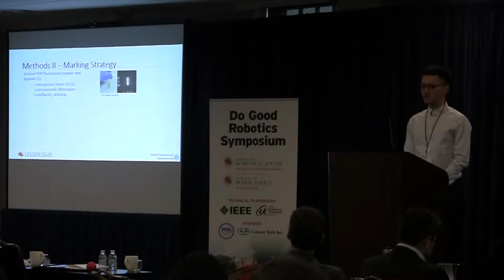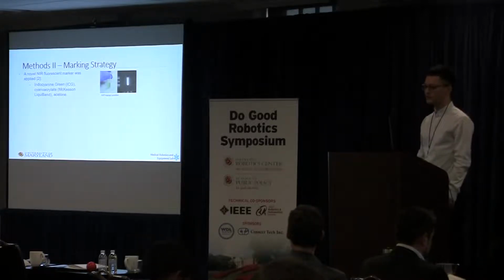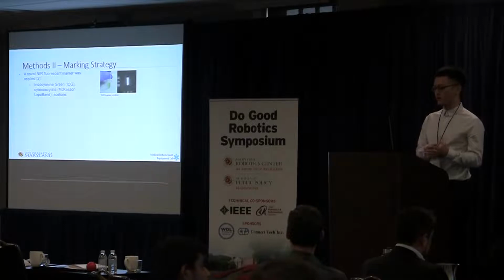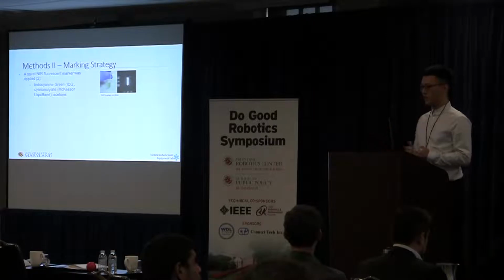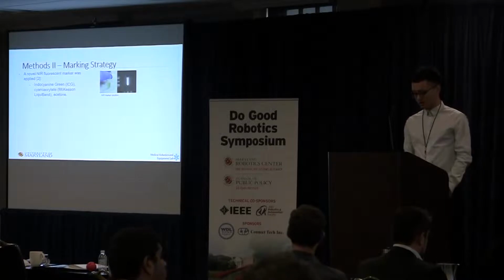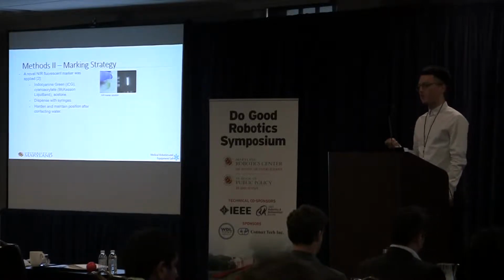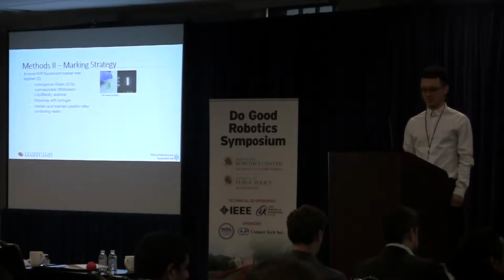We developed this near-infrared fluorescent marker by mixing indocyanine green powder, cyanoacrylate and acetone. It looks like those green solutions in the image. If we shoot an external near-infrared light source on it and capture it using the near-infrared camera, the right image shows how the solution looks. It gives us a very good signal-to-noise ratio. And those solutions can be dispensed with syringes onto the targeted tissues. Once it contacts water, it will quickly harden and maintain its position for at least 6 weeks.